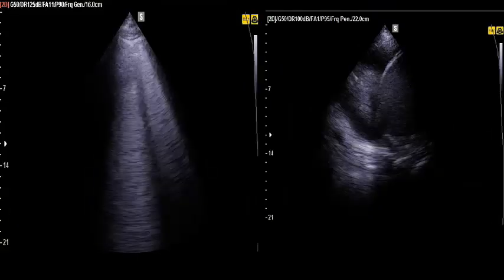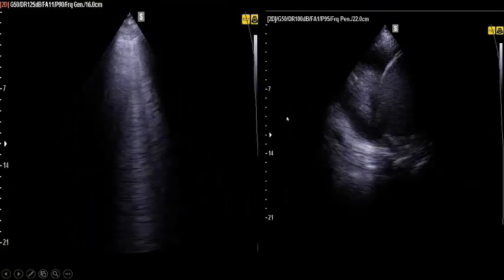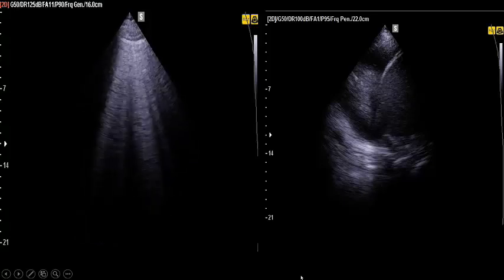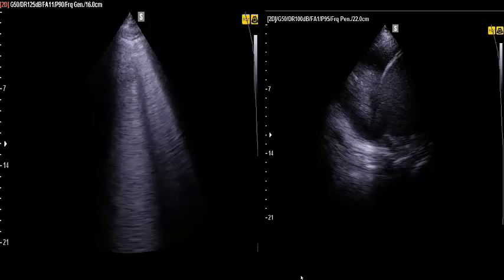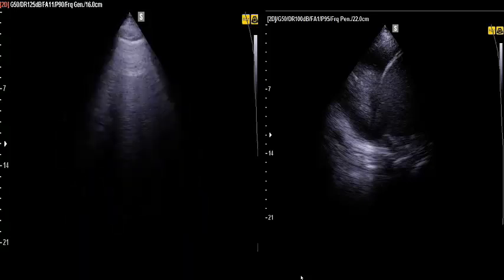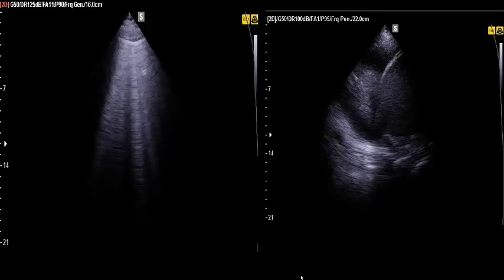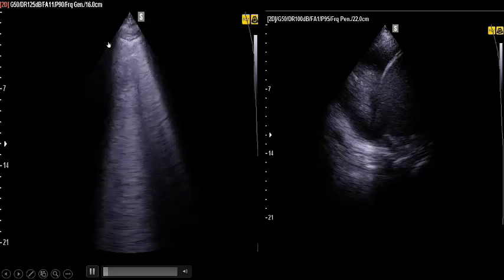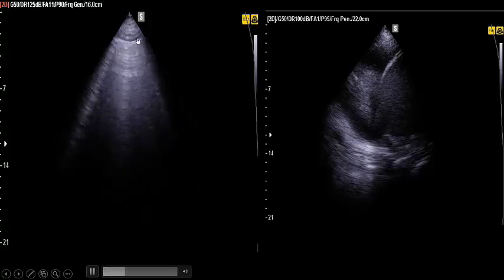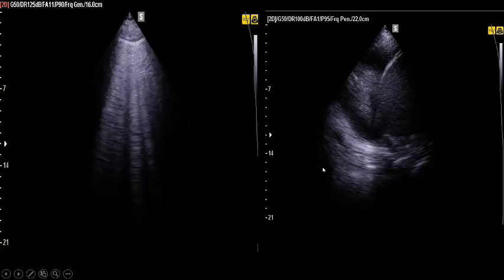So what about dyspnea and hypoxia in our patient? You have now severe left ventricular dysfunction. You have restrictive pattern diastolic dysfunction grade 3 with increased left atrial pressure. You have very low stroke volume, and when you scan the lung in our patient, there is clean pleura with B-lines and right pleural effusion. It's going with cardiogenic pulmonary congestion.